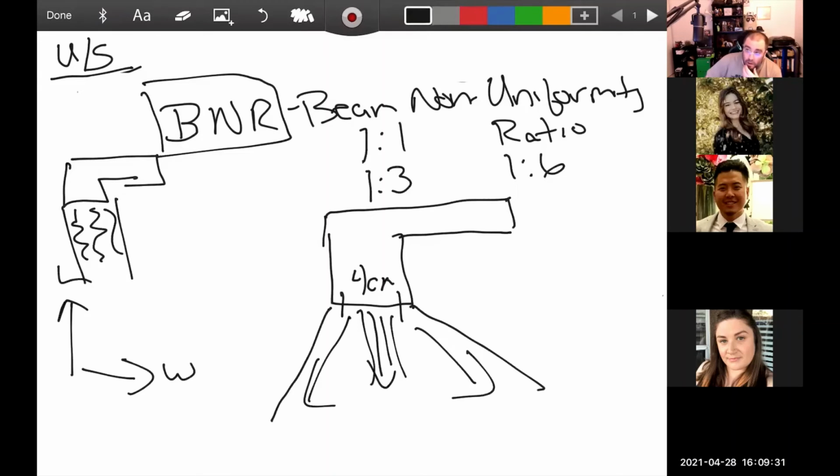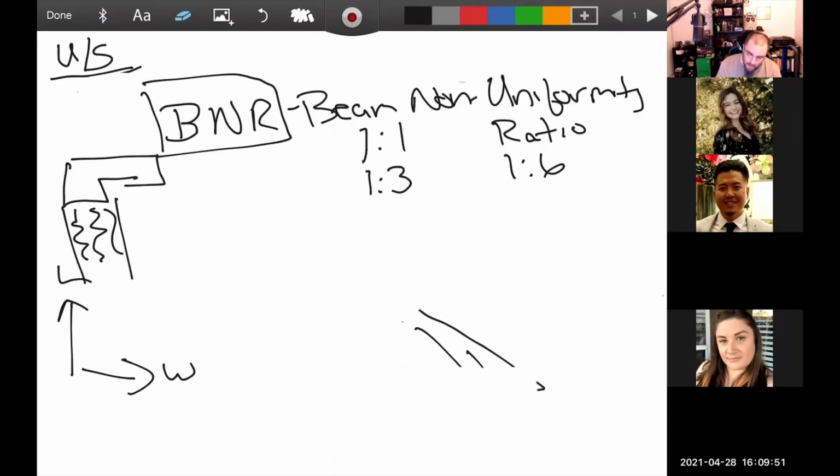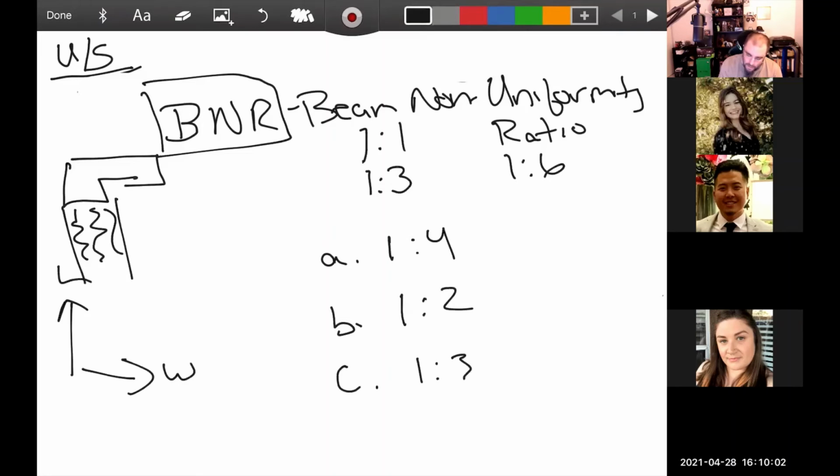So for your BNR, the only thing you're really ever going to get a question on is, what is a better BNR? A lower number is a better BNR. So 1 to 2, 1 to 1 is ideal, right? If I had a question on your test that said, which of the following sound heads has the best BNR? A, 1 to 4, B, 1 to 2, C, 1 to 3, or D, 1 to 12. Which of those would have the better BNR? 1 to 2. Yeah, the 1 to 2.